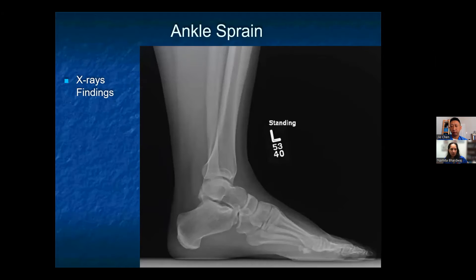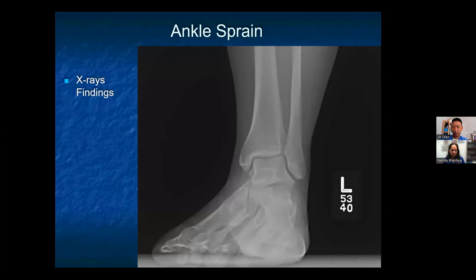On the lateral view, we check the tibia, fibula, talus, cuboid, navicular, calcaneus, and fifth metatarsal — all of which look good. The distal fibula should be superimposed by the posterior distal tibia, the talar dome should be superimposed, and the joint space between the tibia and talus should be uniform. On the mortise view, the lateral and medial malleoli are in profile, the mortise is uniformly visible, and the base of the fifth metatarsal shows no fractures.